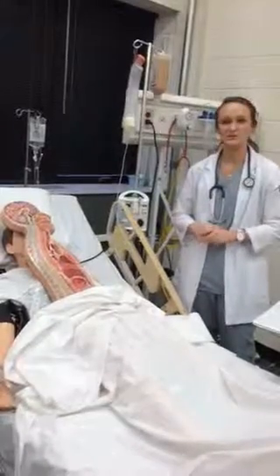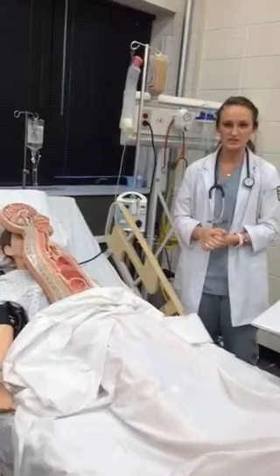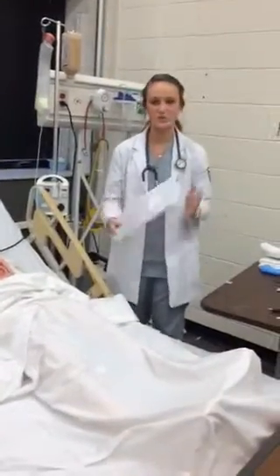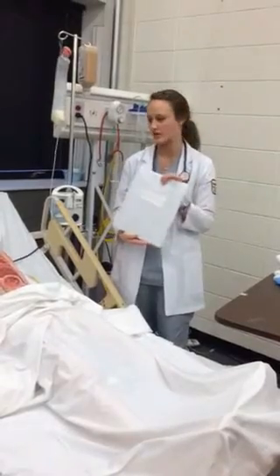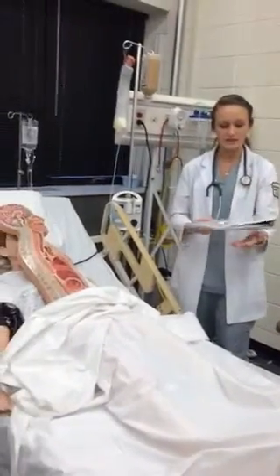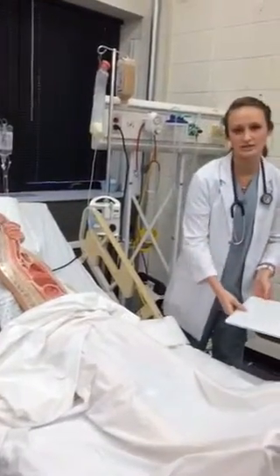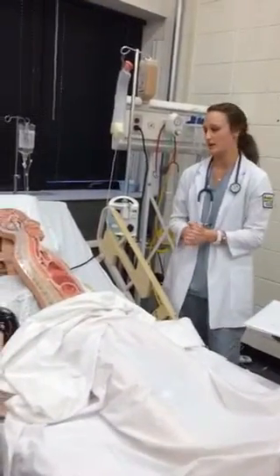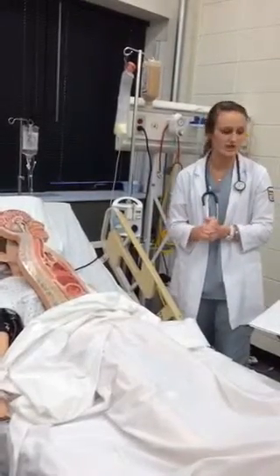Name is Nikki, and I'm going to be putting an NG tube in this patient. The first thing we want to do is get the physician's order and make sure that everything is right: patient, date, everything. And look at the history, the nasal surgeries, if there have been any, anything like that where we could injure what's been done, any sutures or anything.